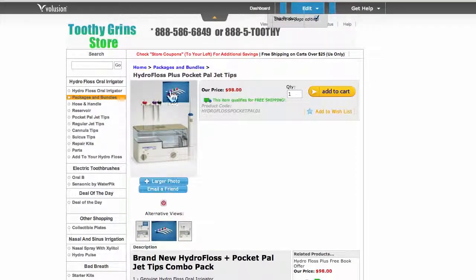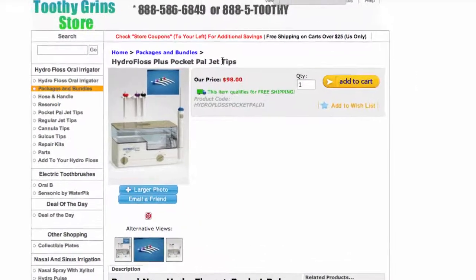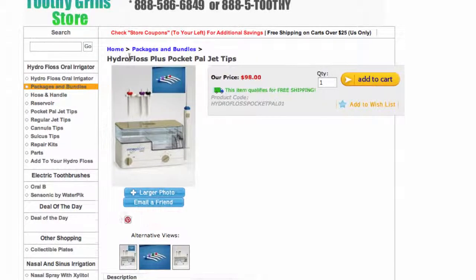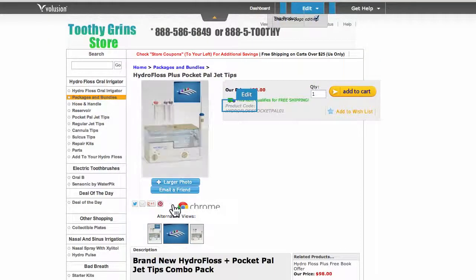This is Dave with ToothyGrinStore.com. Today I'm starting with a video about the HydroFloss and PocketPal Jet Tips combination package. You can get them both for the same low price that you would get just the HydroFloss alone. This is the HydroFloss plus PocketPal Jet Tips combo package.